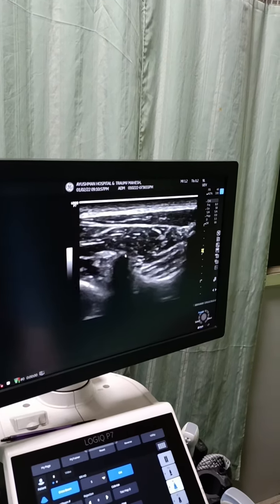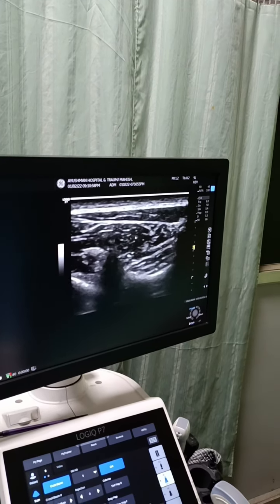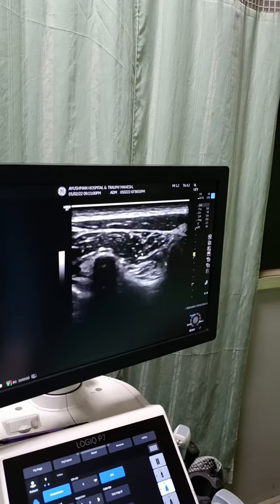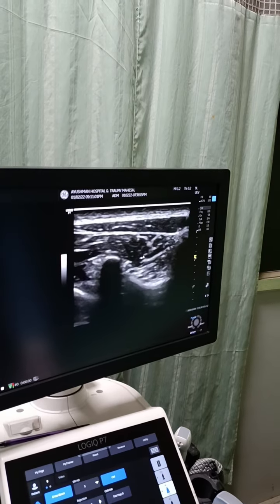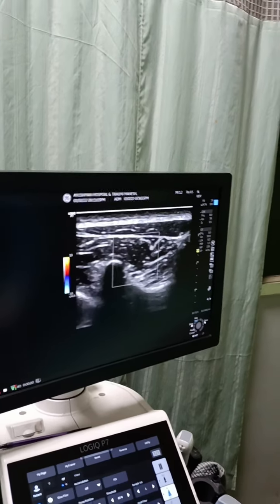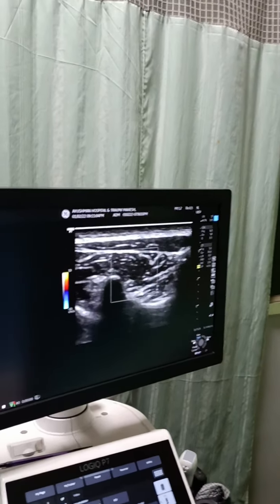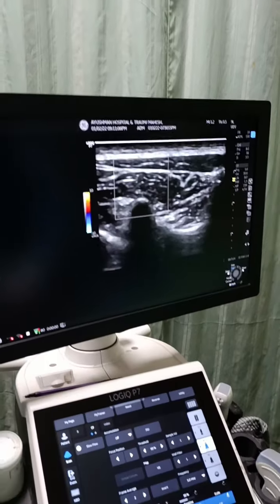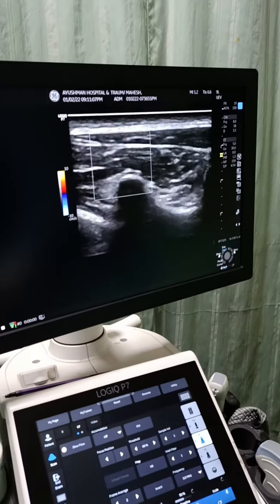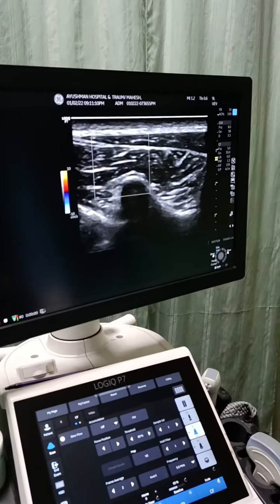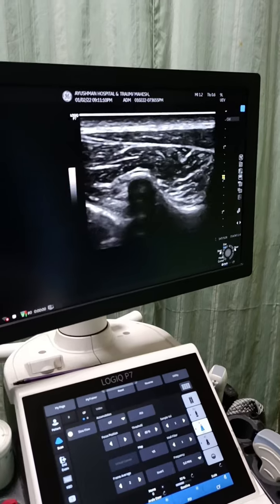These are the erector spinal muscles. We must apply Doppler whenever we do a block so that we don't hit any vessels. I don't see any vessels in this territory, and now we will do the block.